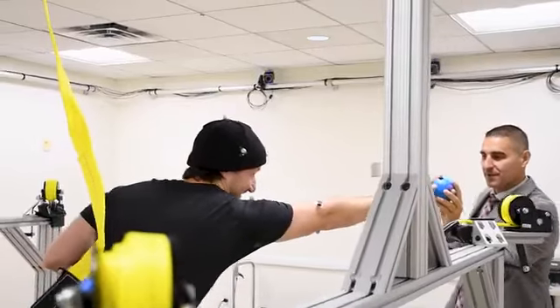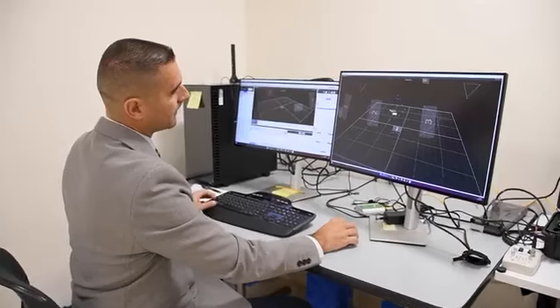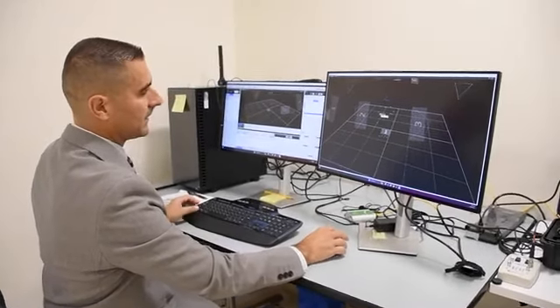An advantage of having our motion analysis laboratory here at NYMC and within this clinical network is that we can use the lab for education purposes, so our doctor and physical therapy students can learn about the movement, visualize and fully understand it here with all the equipment that we use for research purposes, but also we will be bringing people with different disabilities. So the ultimate goal will be to improve the quality of life of people, children and adults who live with motor disabilities.